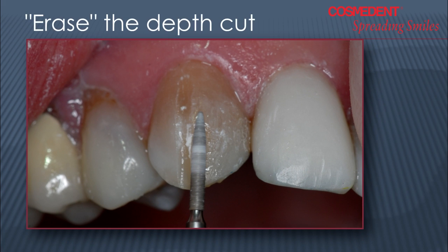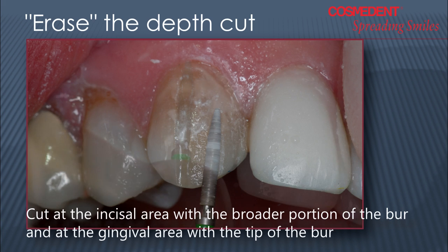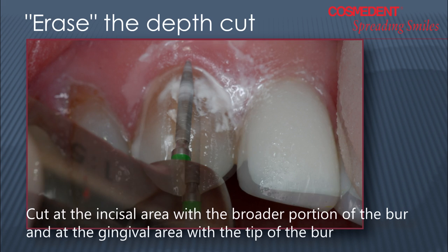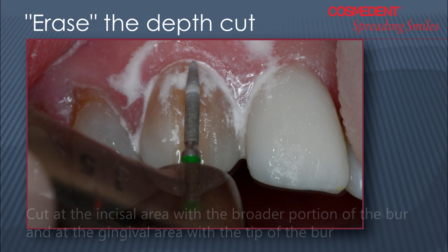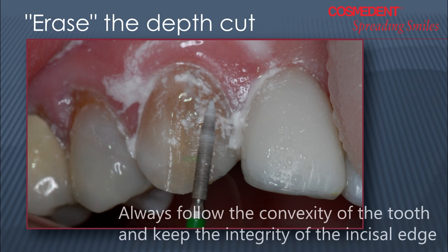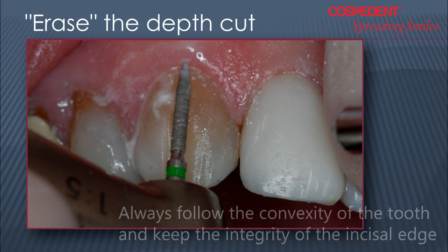Then I'm going to go from one side of the tooth to the depth cut, erasing out the depth cut and moving the burr from incisal to gingival. I tip it so that I cut the wider area at the incisal down towards the tip of the burr as I tip it towards the gingival, following the convex of that tooth and erasing out the depth cut. I will take the tip into the interproximal — not the whole burr into the interproximal — so that I can reserve the integrity of the incisal edge. This can be done with a high-speed handpiece or an electric handpiece running at 40,000 RPMs underwater.